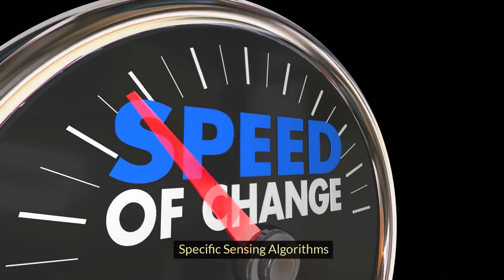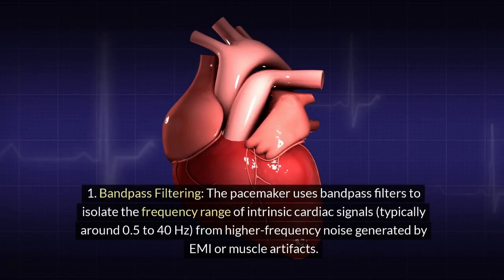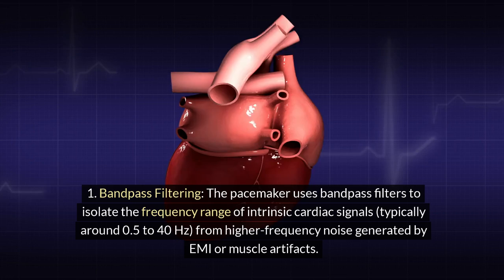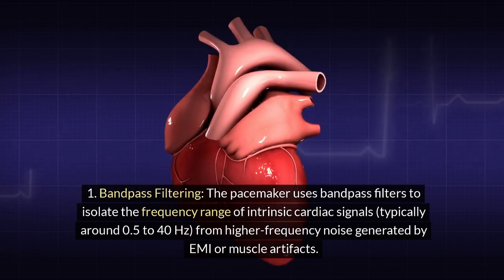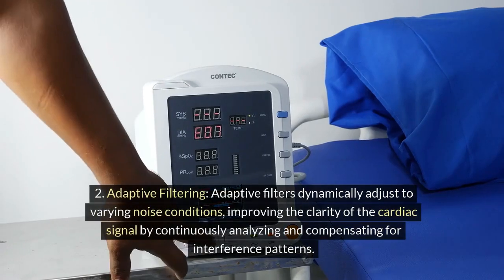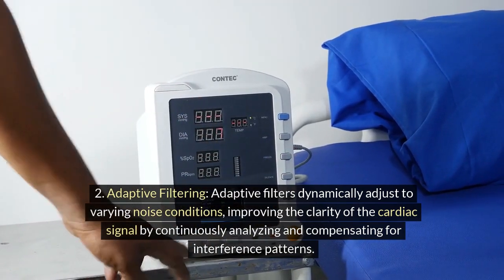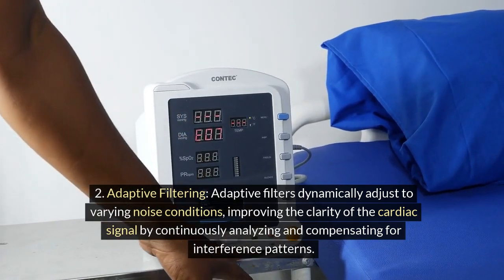Specific sensing algorithms. Signal filtering and noise reduction. 1. Bandpass filtering. The pacemaker uses bandpass filters to isolate the frequency range of intrinsic cardiac signals, typically around 0.5 to 40 Hz, from higher frequency noise generated by EMI or muscle artifacts. 2. Adaptive filtering. Adaptive filters dynamically adjust to varying noise conditions, improving the clarity of the cardiac signal by continuously analyzing and compensating for interference patterns.